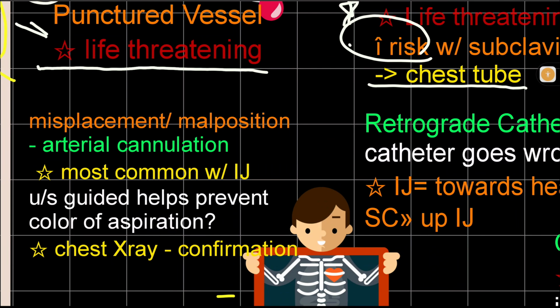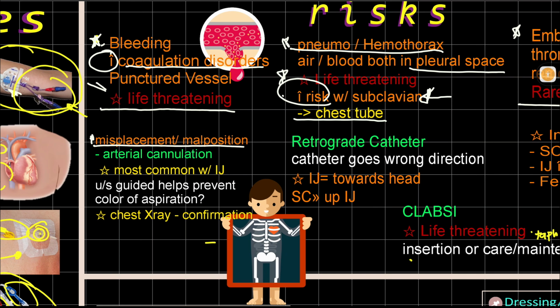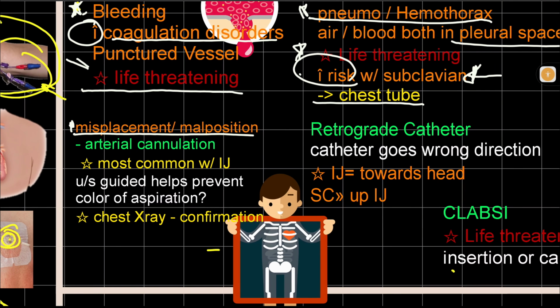Other risks include misplacement and malposition. Now, this is related to insertion, during insertion. Like I told you earlier, we talked about arterial cannulation.